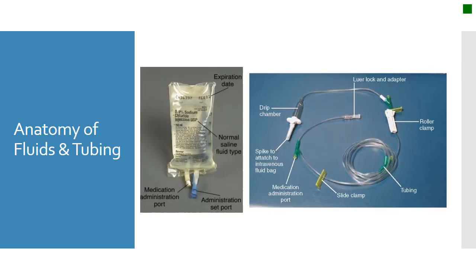Okay, so now we come to the anatomy of fluids and the tubing. As you can see on the picture on the left, this is a solution of sodium chloride injection. It also has clearly labeled its expiration date. Yes, fluids do expire. It will also tell you the amount that is on there. This bag has 250 milliliters of this solution in this bag.